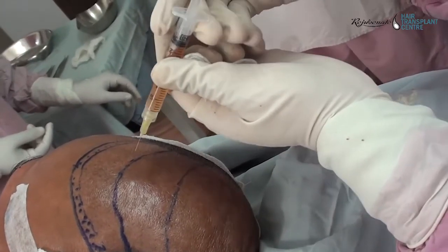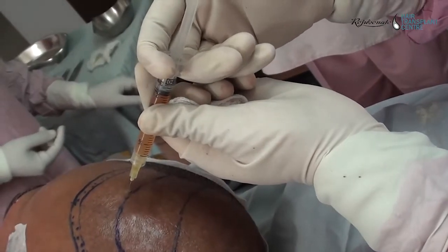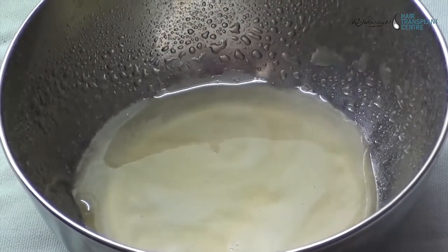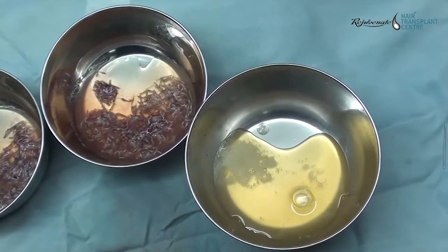The PRP is loaded into a 3 ml luer lock syringe with a 30-gauge needle. This is the recipient area — PRP is injected into the entire recipient area just before starting implantation. Another syringe filled with plasma is used as the graft holding solution, kept in multiple glass petri dishes or a steel bowl.